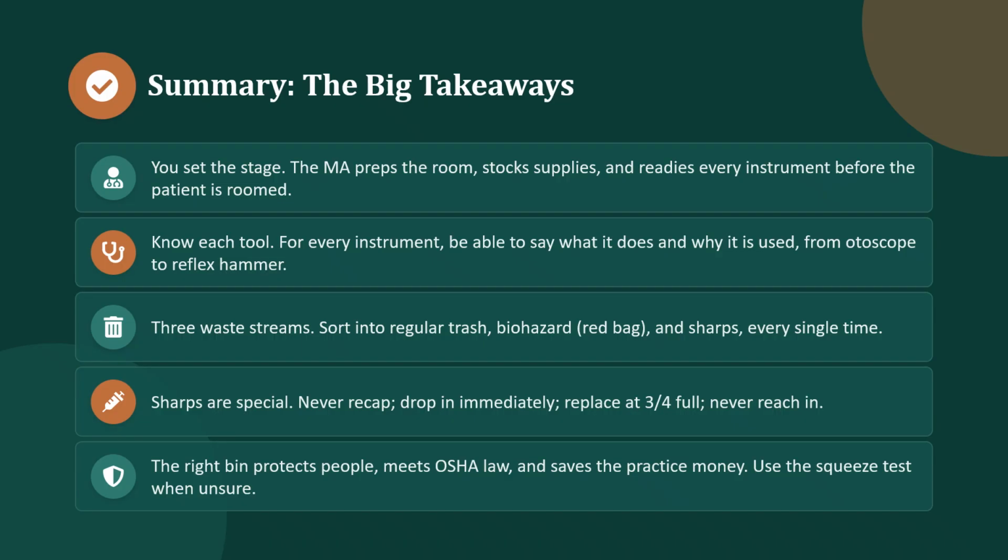3. There are 3 waste streams, not one. Regular trash, biohazard in the red bag, and sharps. 4. Sharps get special respect. Never recap a needle, drop it in immediately, swap the container at 3/4 full, and never reach inside.